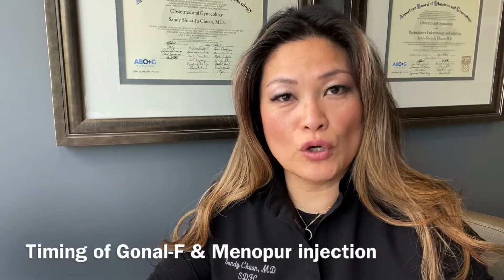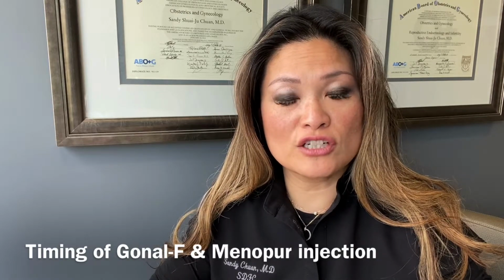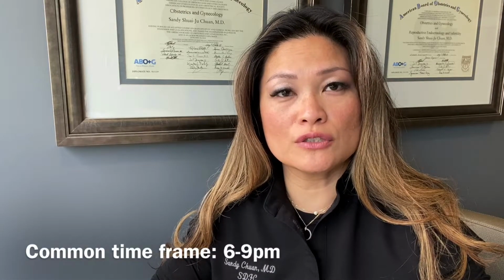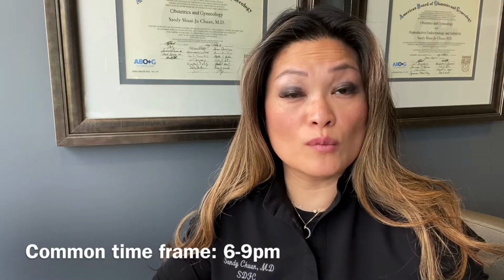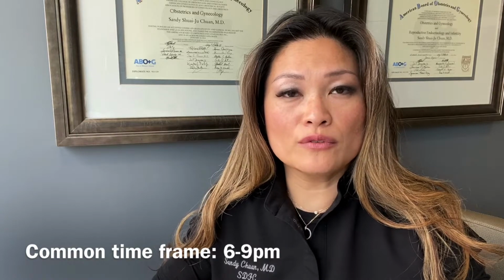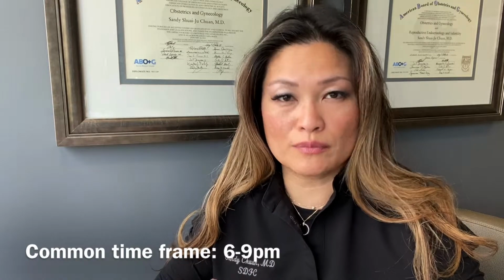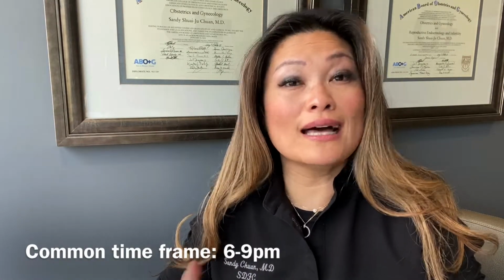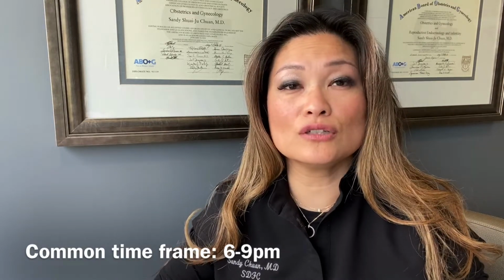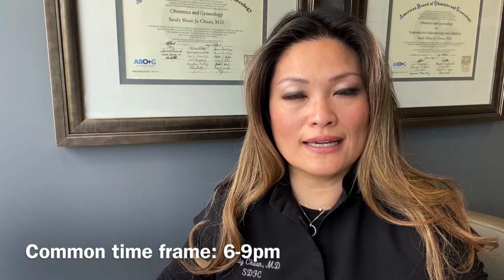So now you've got your Gonal-F and your Menopur ready. And usually you're going to be doing your first injections in the evening, and typically people are doing their shots between 6 to 9 p.m. at night, usually when they get home from work or their day. What you want to remember is that these medications are potent or effective for about a 24-hour period, so you really don't want to go outside of your 24-hour window from the last time you injected it. So let's say you took it at 7 p.m. the night before, then you want to do it around 7 p.m. the next night. Now between probably 6 to 8 is fine.